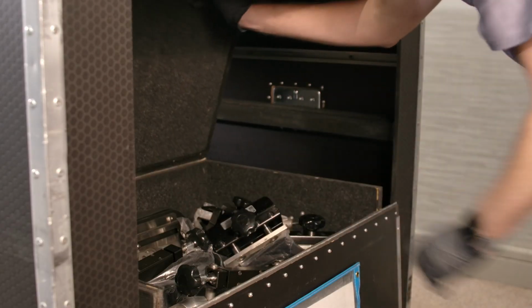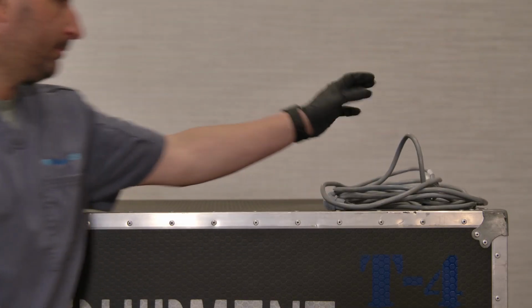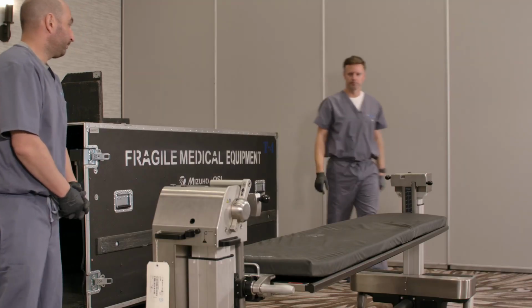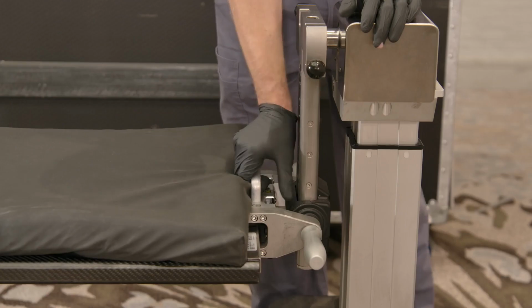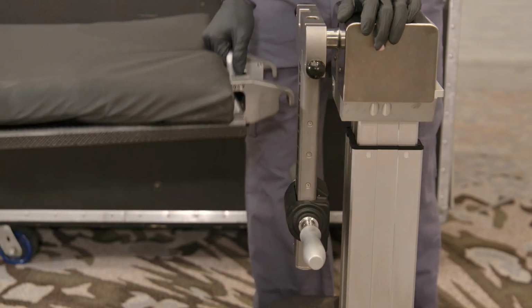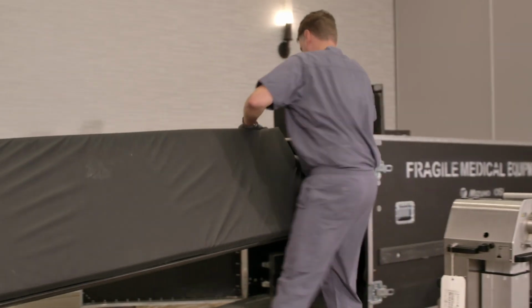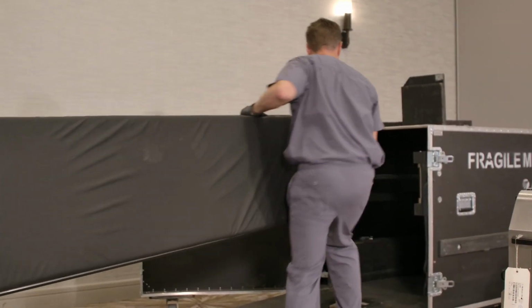Depending on the lab, you may see the spinal surgery accessories or the radiolucent imaging accessories. Once all the accessories have been removed from the table, lift the tabletop from the Trios tabletop and place back in the crate. When inserting the tabletop to the crate, align the tracks on the table base to the crate tracks. Once the tracks are aligned, slide the table into the crate.